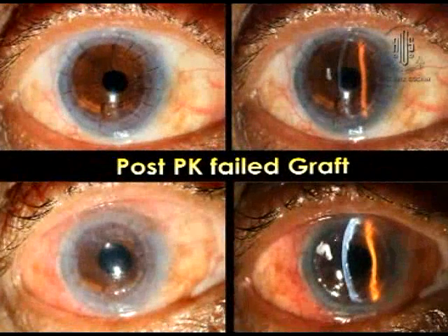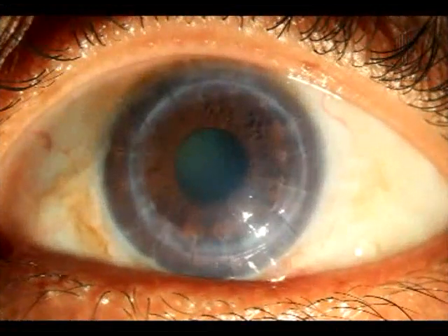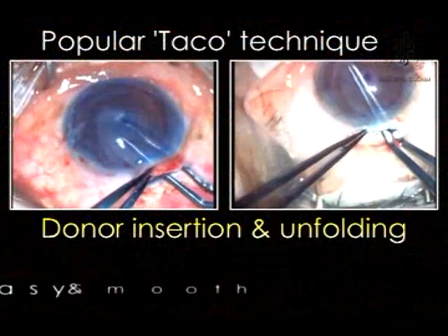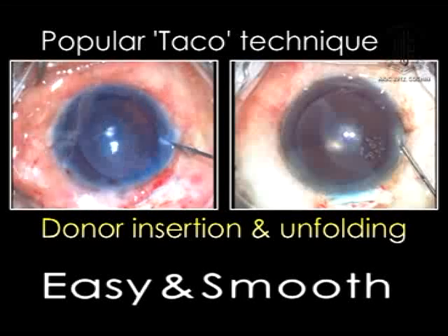After penetrating keratoplasty, when the patient presents with failed graft with a good surface and anterior segment, DSAEK is a viable alternate option. In routine DSAEK, the popular taco technique and unfolding is always easy and smooth.